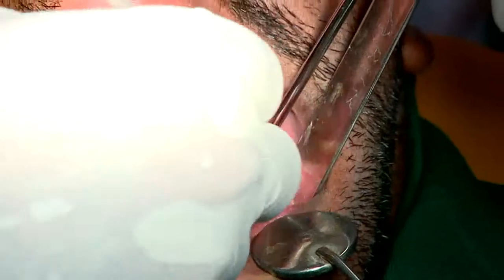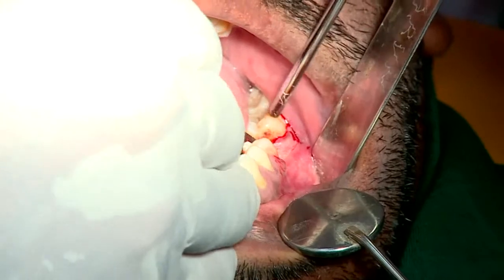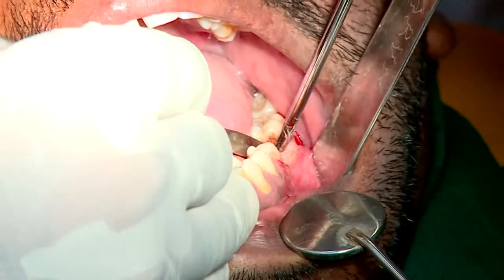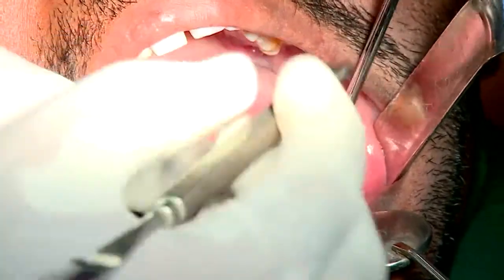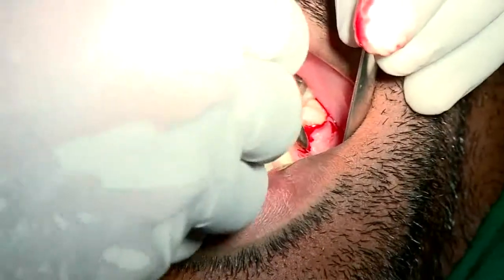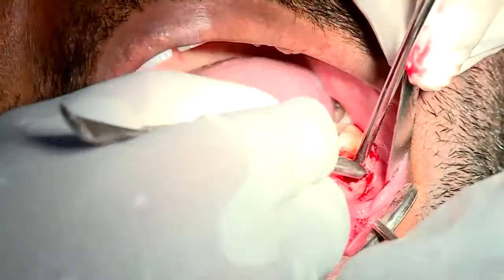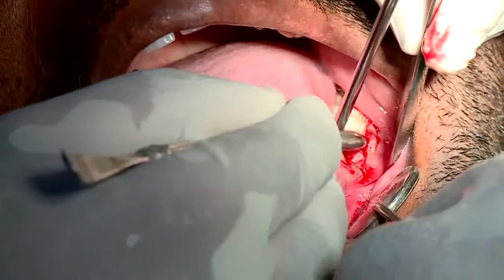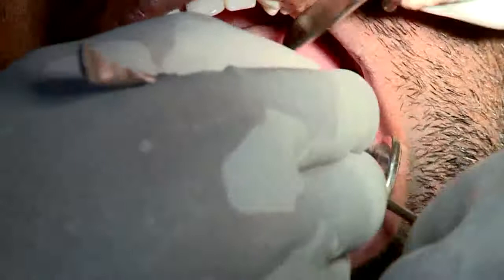So nowadays we do something called off-crestal. We want to maximize the keratinized mucosa around the implants, so we reposition the keratinized mucosa from the lingual aspect. We do an off-crestal incision and reflect the mucosa, so that when suturing, all the keratinized mucosa, the attached gingiva, will be on the buccal side. The implant's long-term survivability depends on exact soft tissue management. Over to you, sir.